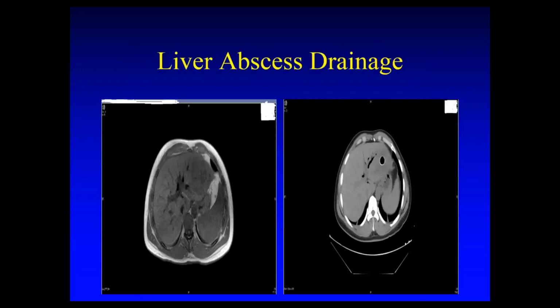This is a case that I did recently. It's not commonly done. A very large 6-centimeter liver abscess in the left lobe of the liver.